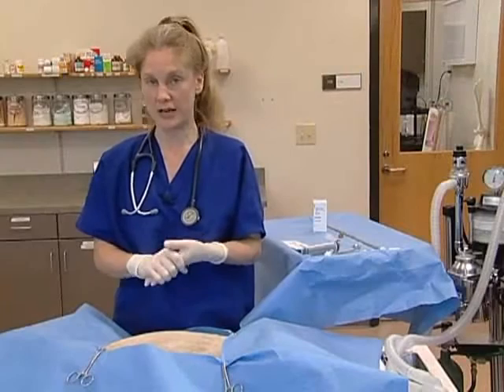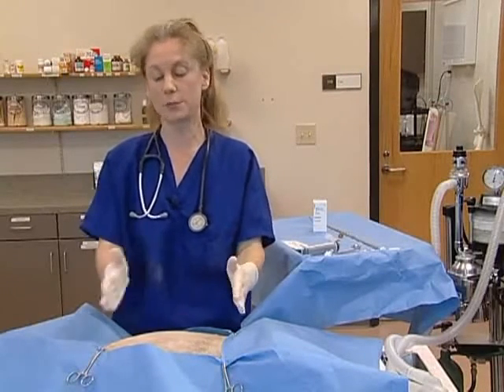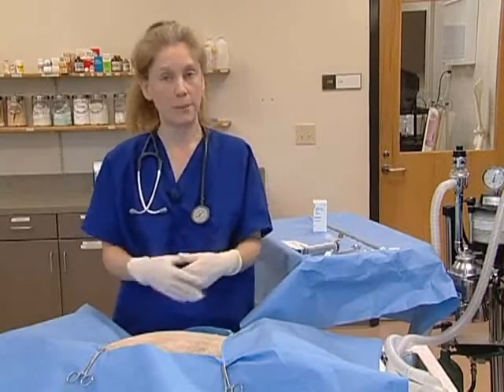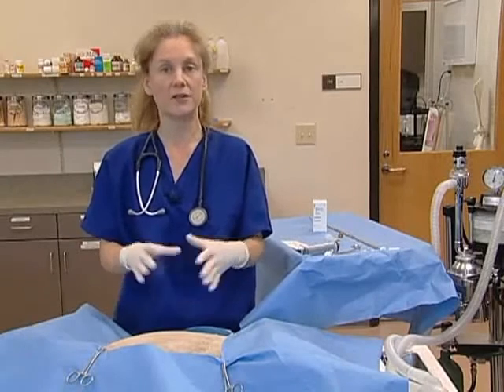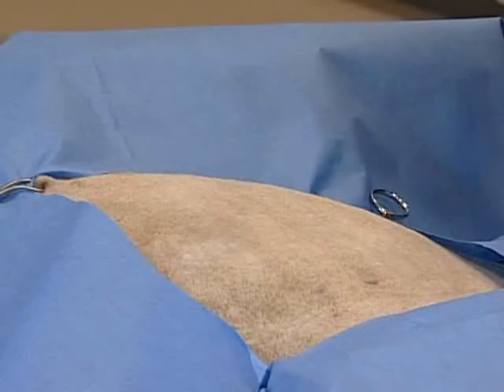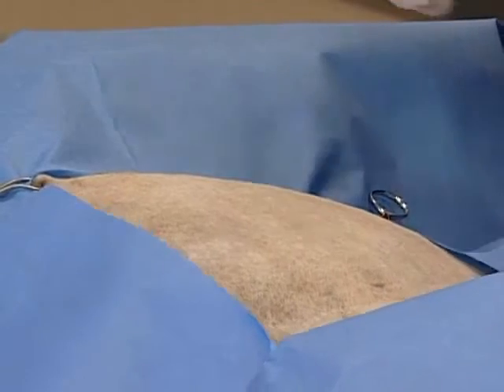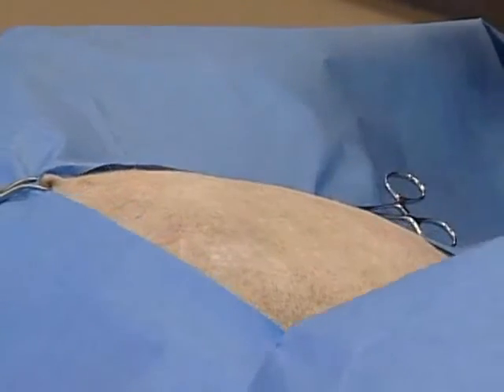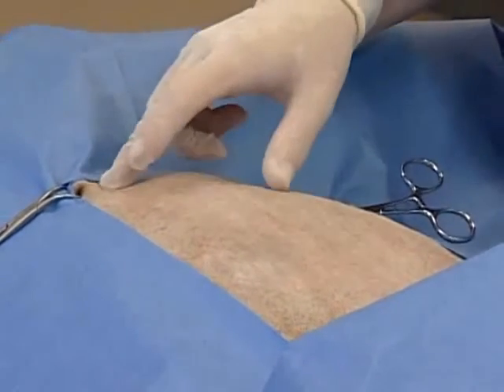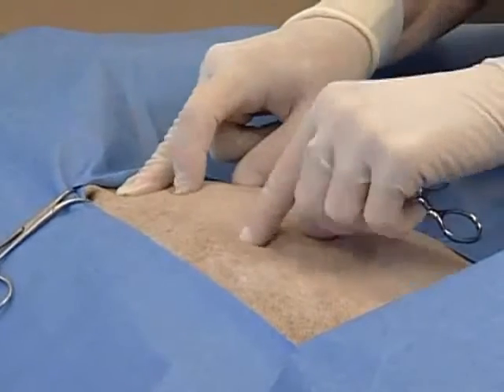In order to place a chest tube you must first clip the lateral chest from the scapula to behind the last rib, sterile prep that area and surgically drape it. Have an assistant pull the skin forward from the scapula, then count back from the thirteenth rib to identify the ninth or eighth intercostal space.